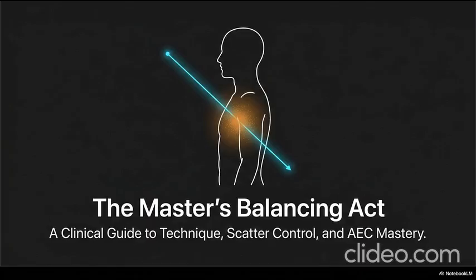The exposure will only terminate when the mechanical backup timer finally trips to prevent the X-ray tube from literally melting. The patient receives a massive, entirely unnecessary dose simply because the machine was blindly trying to see through solid metal. And from what I'm reading, it isn't just surgical implants. The patient's underlying pathology throws the system off too.